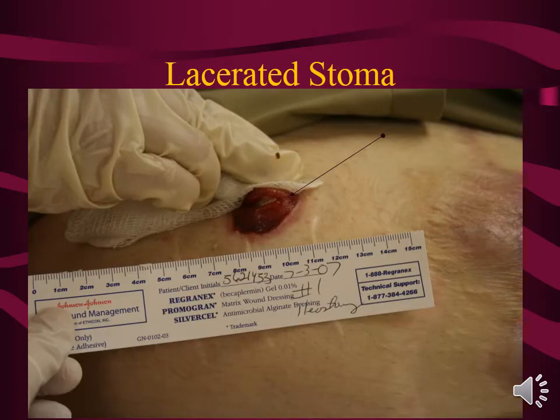This is a lacerated stoma, and you can see erythema around this stoma as well. In this case the patient just got their device cut too close and they did not feel it, and it lacerated into the stoma or bit right into their stoma. So just like if you bite into the side of your mouth, really all we had to do was resize. You can see on the card there it says ileostomy, so we had to resize for them and teach them how to cut that out properly, and it just heals on its own.